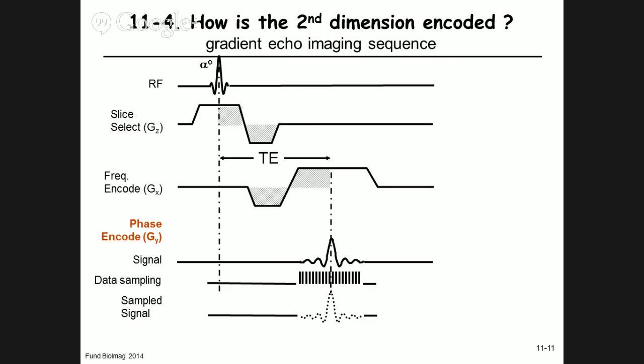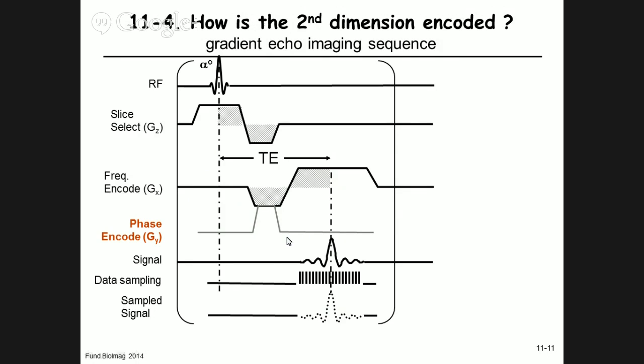We'll review this topic for a few minutes in next week's course. So we'll have the phase encode gradient, and that one is now just turned on for a short period of time here in red. And that's the now complete sequence, except this experiment is now repeated every TR seconds by changing the amplitude of the phase encode gradient by delta GY.